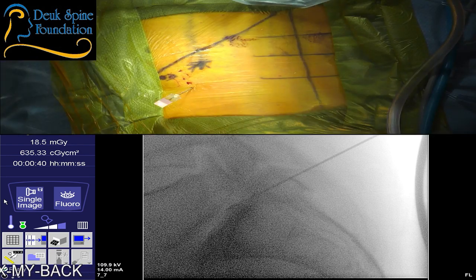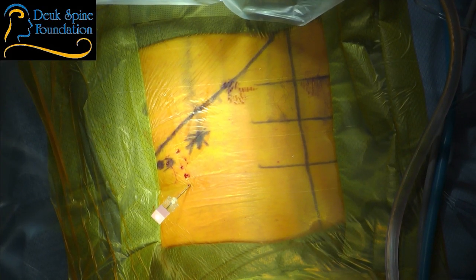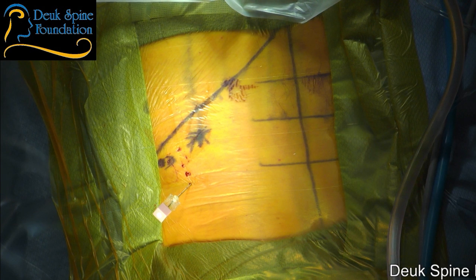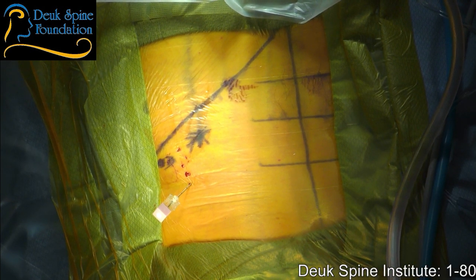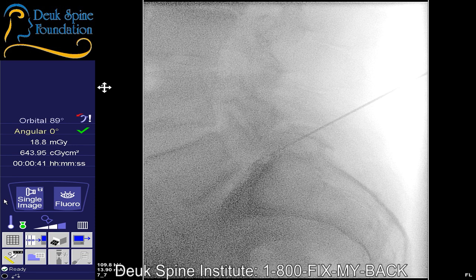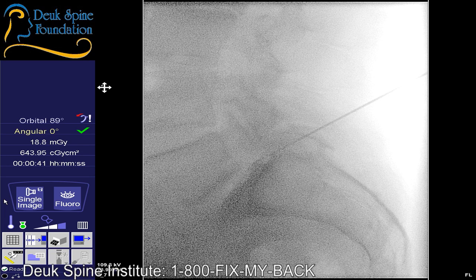Let's come south a little bit, just a small bit, and let's get the table up a smidgen. Good. Let's see where we are. Our end plate seems to be lined up nicely. Right? Are you seeing any rotation there? I'm not. No, I can see.